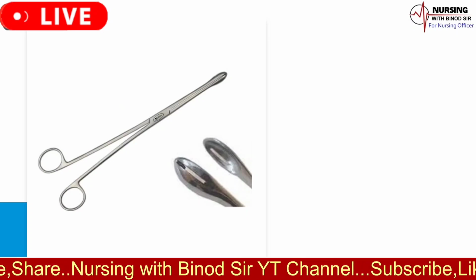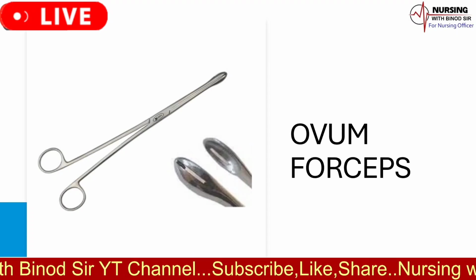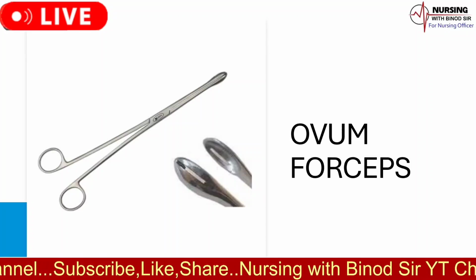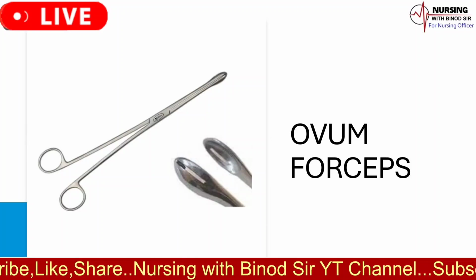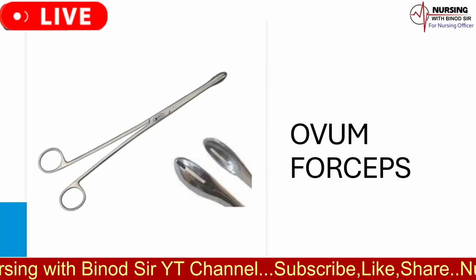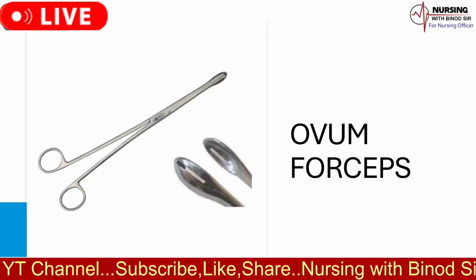Ovum forceps are specialized medical instruments mainly used in gynecological procedures. They are designed to handle delicate tissues within the female reproductive system, such as the ovum and placenta. The uses of ovum forceps are as follows. 1. Fertility treatments. Ovum forceps are crucial in assisted reproductive technology, ART, procedures like in vitro fertilization, IVF, and intracytoplasmic sperm injection, ICSI, where they help in the retrieval of eggs from the ovaries.